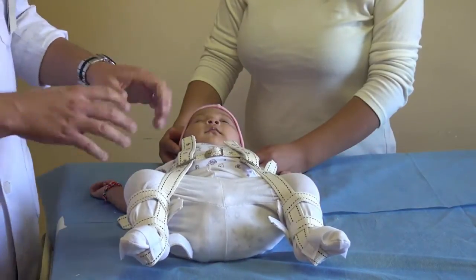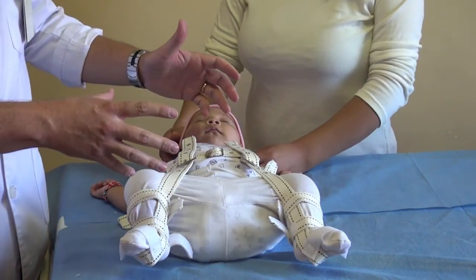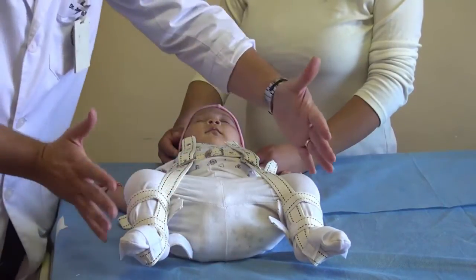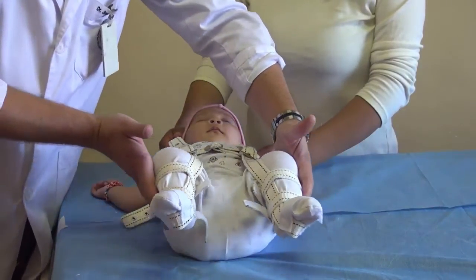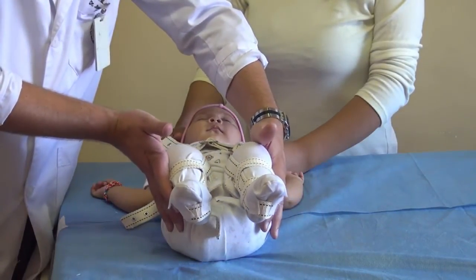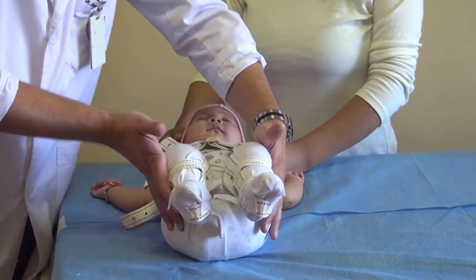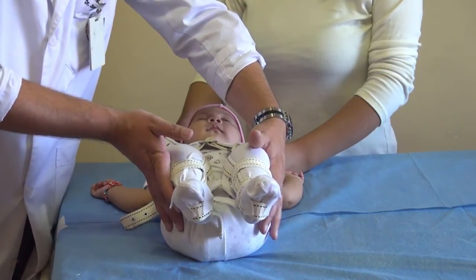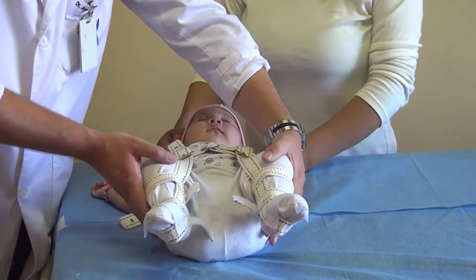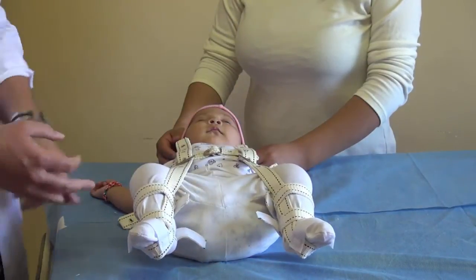When carrying the baby in a car seat made for them, the baby won't fit properly and the abduction won't be possible — the hips will close. But the baby's safety comes first, and car trips are not so long, so that time won't matter. First the baby's safety, then the baby's hips.